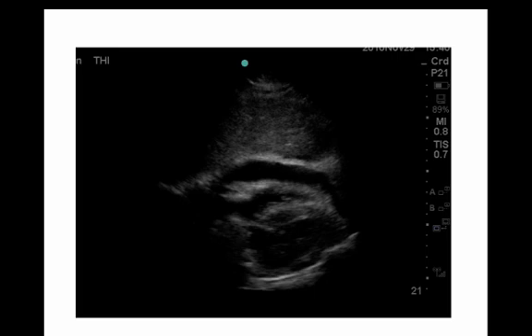In the first study, shown here, which is a screen capture, you can see the area of interest, which is the inferior pericardium. We can also see the heart. Now notice the black area between the pericardium and the heart. This is an anechoic area and represents fluid. This patient has a pericardial effusion. Now, whether this patient has tamponade physiology is a clinical decision. The ultrasound image in isolation cannot make that determination.